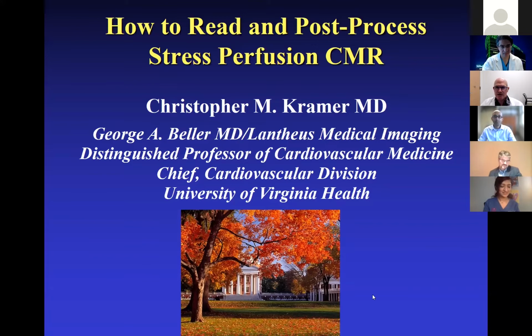We're going to take a few minutes to quickly review how to read and post-process stress perfusion CMR. Much of what I'll tell you is in writing, so you can look it up in Jeanette Schulz-Menger's SCMR Task Force guidelines on how to post-process CMR, published in JCMR in 2020, and the reference will be on my slides.